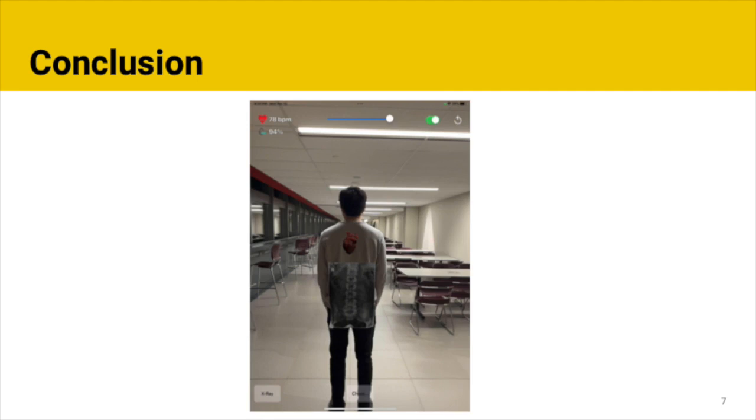Apart from the initial requirements, we were also able to meet some of our stretch goals, such as adding a 3D heart that reflected the data from the oximeter, beating with the given heart rate, and color changing with the given blood oxygen level. Overall, the project was a success, though we did encounter some difficulty in accurately placing medical images and determining body joints, which we overcame using Apple's ARKit's body detection capabilities. There is definitely some room for future work to be done to further improve the product, but we as a team have met most of our goals.